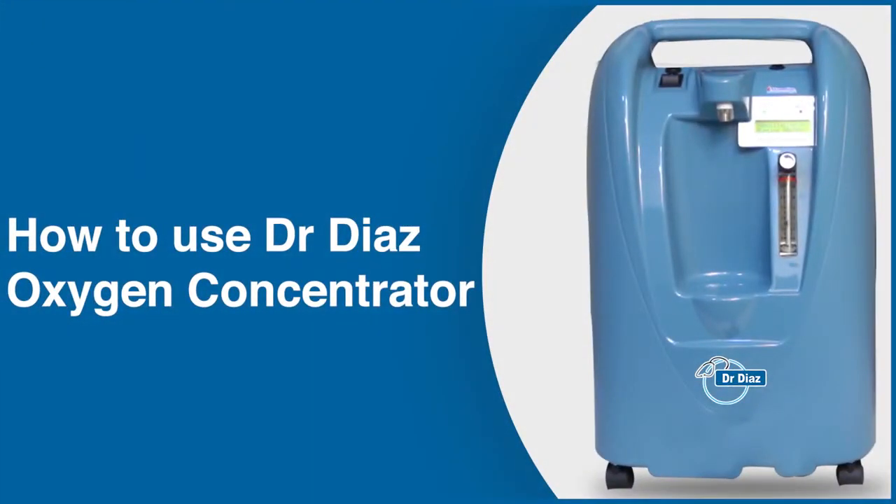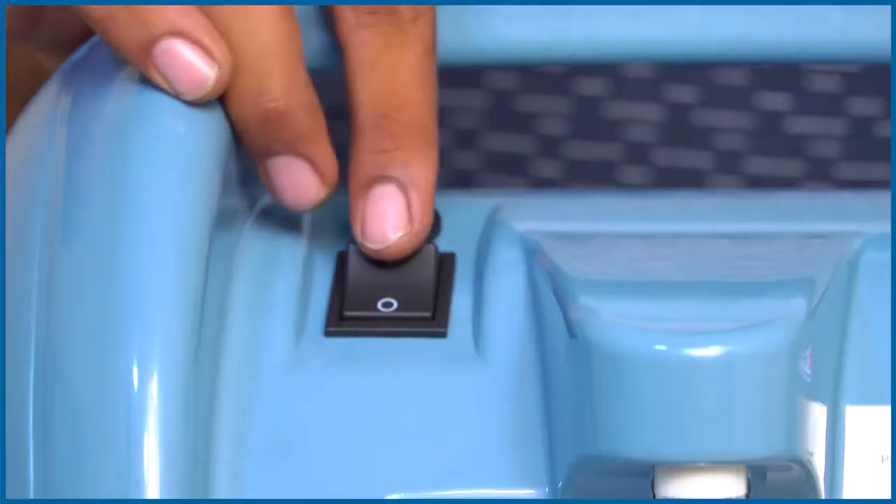How to use Dr Diaz Oxygen Concentrator? Connect the power cord to the main socket and switch it on.